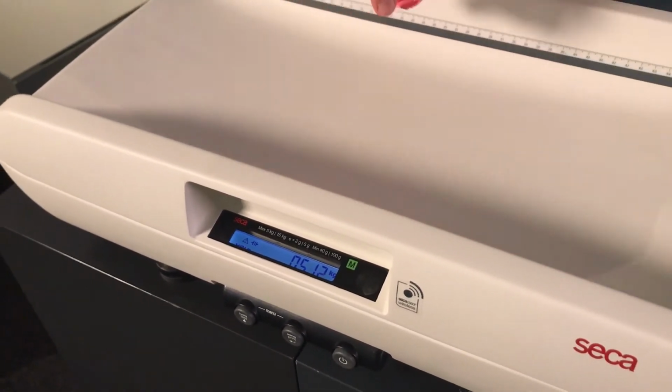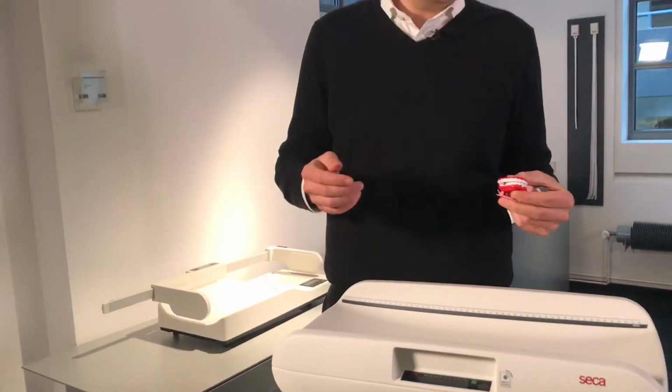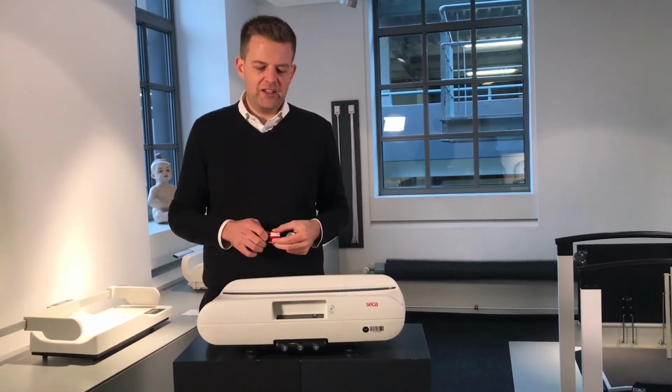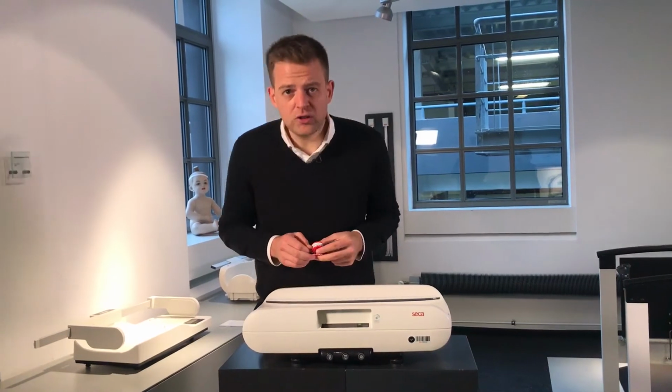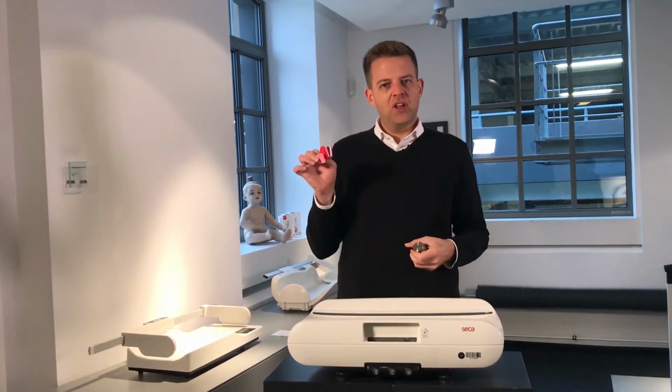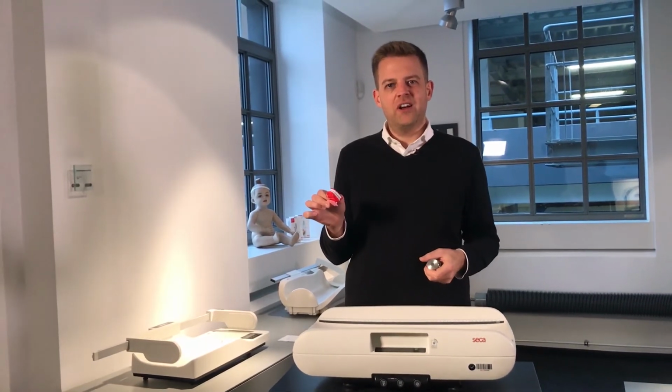Did you hear the beeping sound? With that, within, let's say, a maximum of 2 seconds, the scale found an accurate weight of 512 grams. So 500 gram, one calibration weight, plus the 12 grams that I showed you earlier, which these teeth weigh.